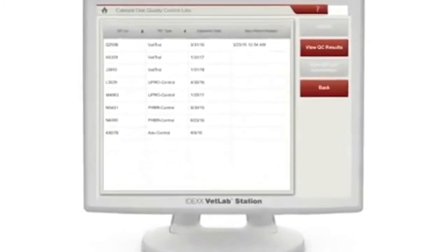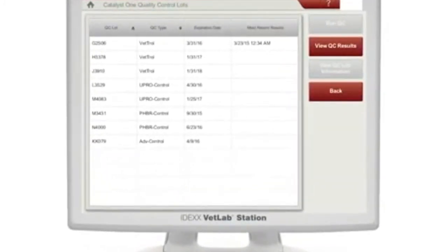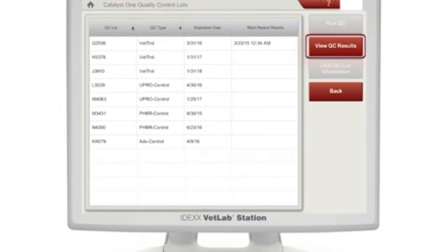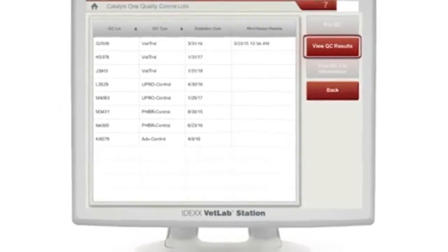To view quality control results at any time, tap View QC Results on the Catalyst 1 Quality Control screen.